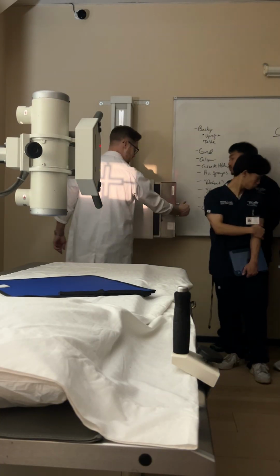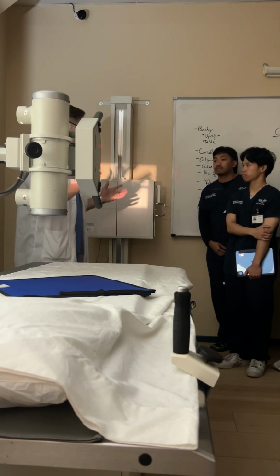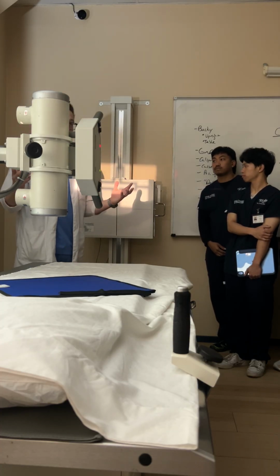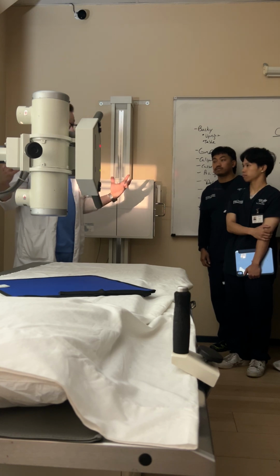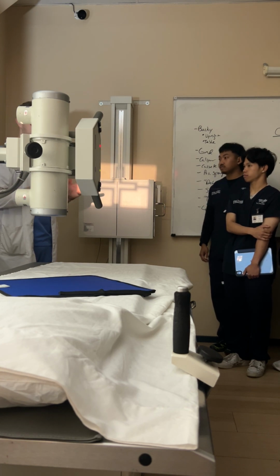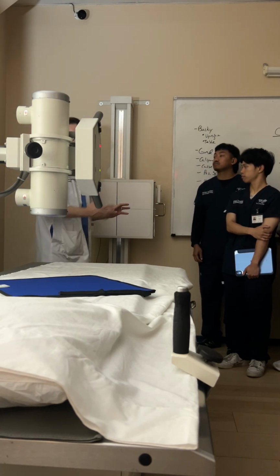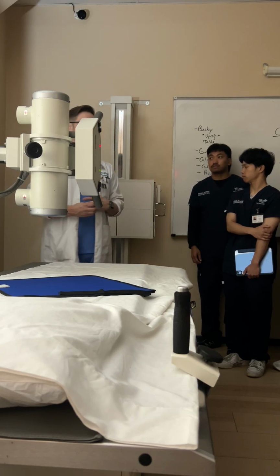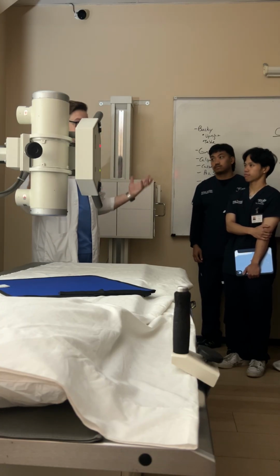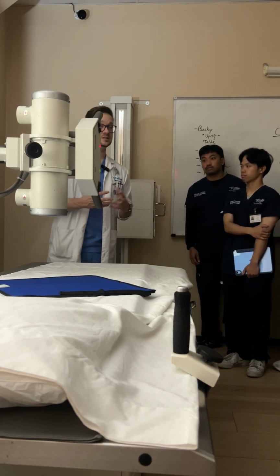I set all of this before I bring my patient in, optimally. Maybe sometimes I won't know what my patient looks like. They might have a really broad chest. And when I go out to the waiting room to get them, I'll notice that they have a broad chest. So maybe I'll need to change the orientation of my cassette from portrait to landscape. Okay, it's one of those things where we just have to be mindful of body habitus and remember how lungs can change depending on someone's body habitus.